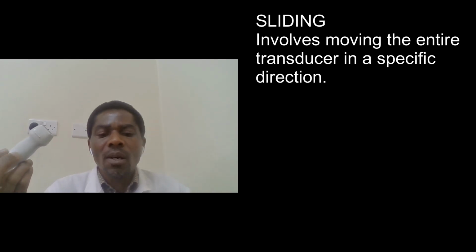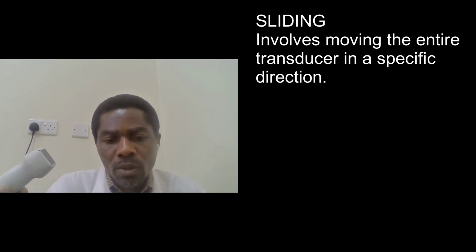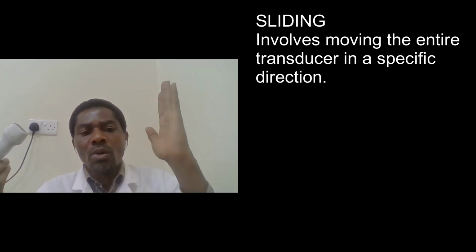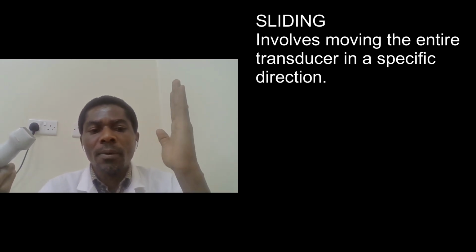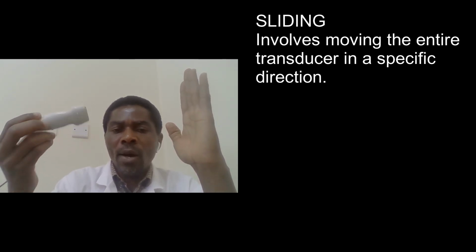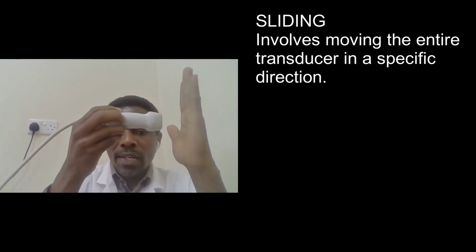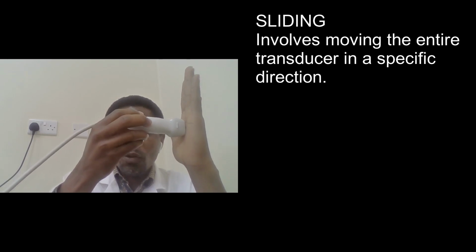Sliding involves moving the entire transducer in a specific direction. So let's suppose this is our patient and this is our transducer. So when sliding, you move the transducer in any direction.